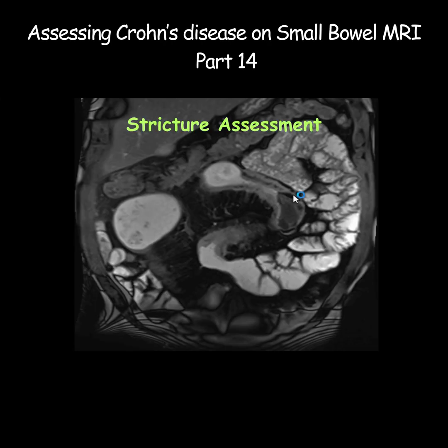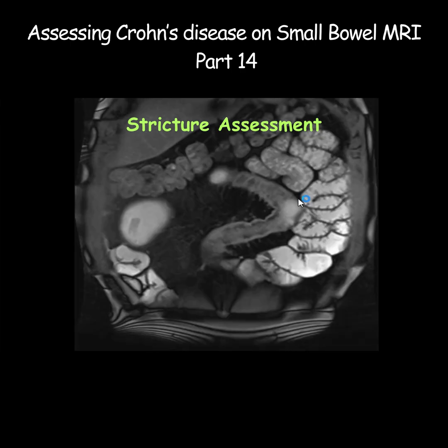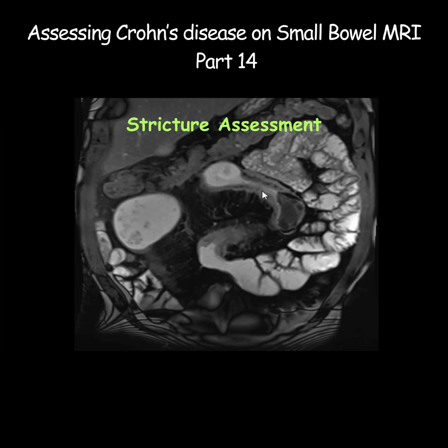Remember that sometimes even with the presence of strictures you wouldn't see pre-stenotic dilatation, and that's when the small bowel is being decompressed by some other way — by the presence of fistulae or sinuses. For instance, if this segment is strictured and there is some decompression going on by this loop fistulae with another small bowel loop, then the proximal small bowel wouldn't have enough pressure on it to cause pre-stenotic dilatation.